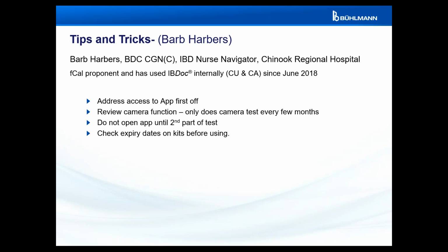And then my last point here, and this has actually just happened recently, because I have patients that are now repeating their tests at the 3 or 6 month mark, it didn't click into my head either to check the expiry dates on the kits they had, but some of them had expired kits, and they will not work, we discovered. They will run the test, but they won't give you a response, or they'll give you a not applicable or something to that effect. And so I always ask my patients now to make sure they check the expiry dates on their kits before they use them. If there's a problem, they can always contact me, and then I'll get them new kits.